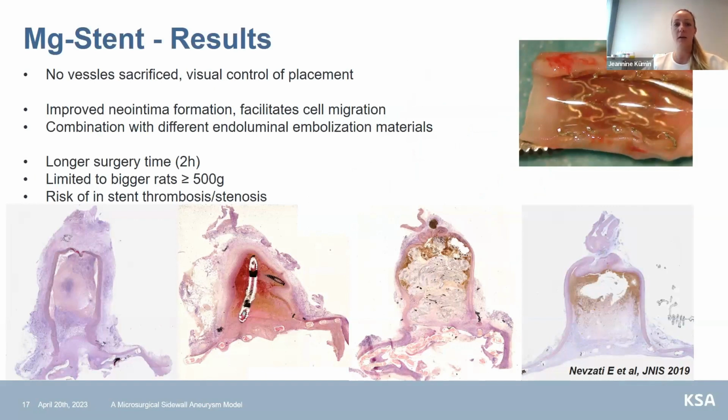And we have a benefit of the combination of different endoluminal embolization materials, which can be used together with the stents, such as BioEmbolisation materials or also coil treatment.